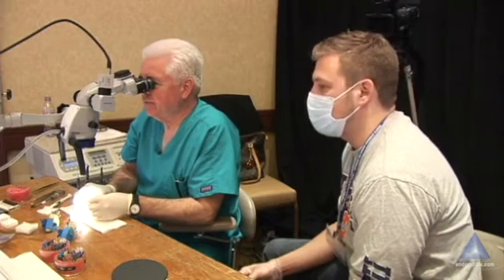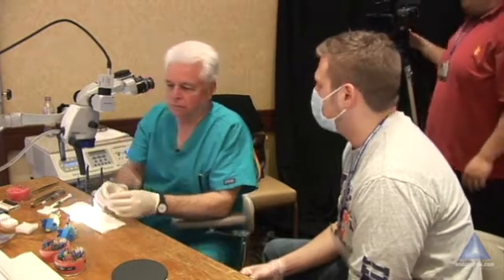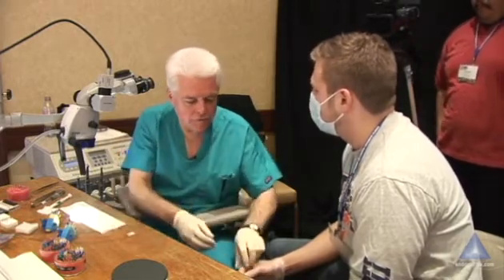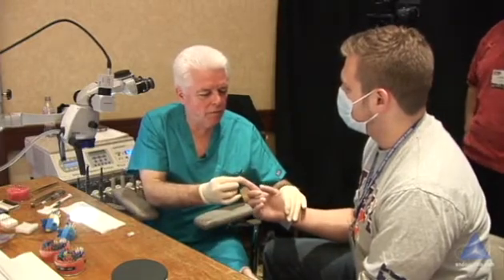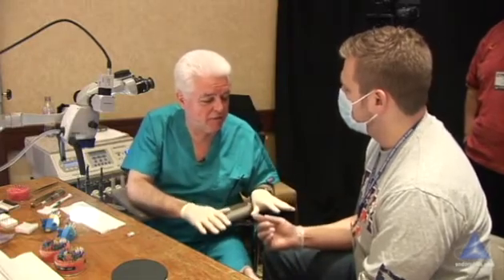I've had that happen — and then it's like, gosh, if I keep attacking, I just want to make a ledge, and then I'm just like, well, I guess that's where we're finishing this case, until I sit there and dig with it forever. Don't — just do this. Wiggle, wiggle, wiggle, pull. Wiggle in a little bit deeper, snug, pull. But when you're wiggling, it's loose, but it's getting snugger as you go down.